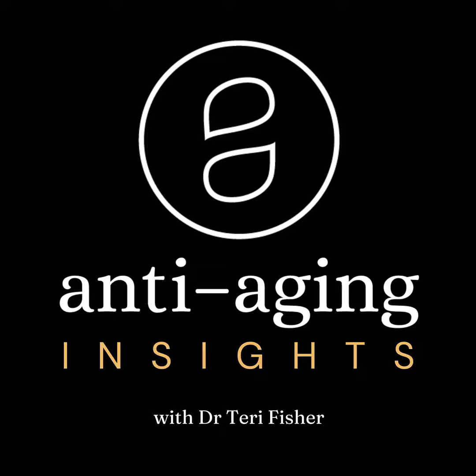The higher the number in the gauge, the smaller the diameter. So a 30 gauge needle is thinner than a 27 gauge needle. And to give you an idea, oftentimes when we're doing a neuromodulator injection like Botox, we are using something like a 30 gauge needle. It's very, very small. It's a similar needle to what people with diabetes use when they have to inject insulin.